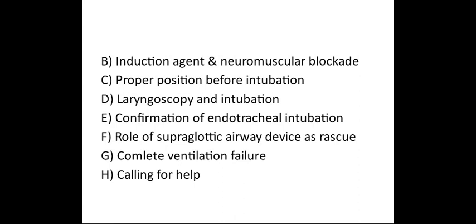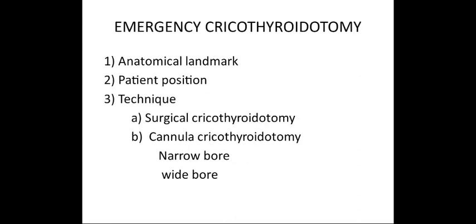Now, H, calling for help. We should call for help as early as possible when the first difficulty in airway management is encountered. Then we will now discuss emergency cricothyrotomy. It is necessary when there is complete ventilatory failure, when we are not able to intubate, ventilate with face mask, and unable to put a supraglottic airway device.